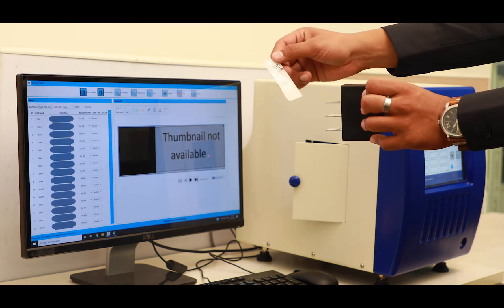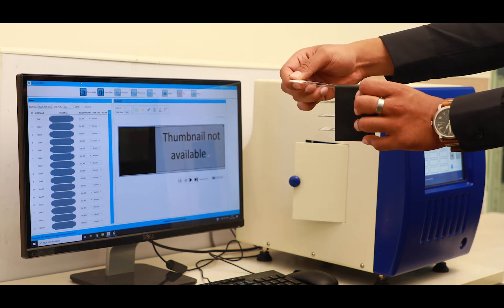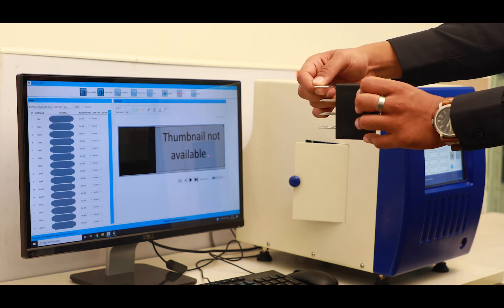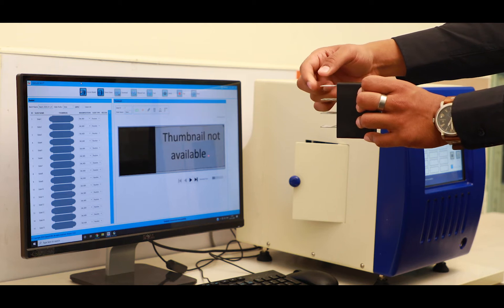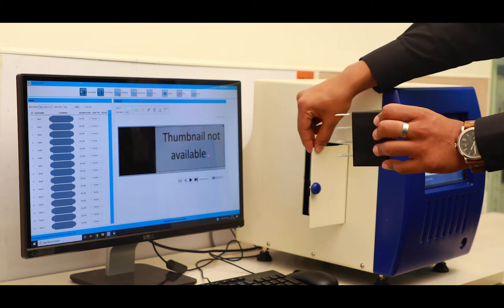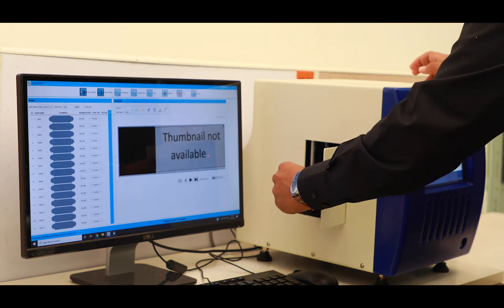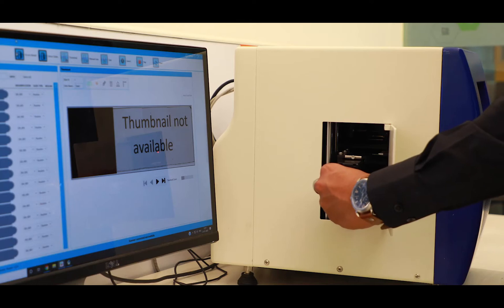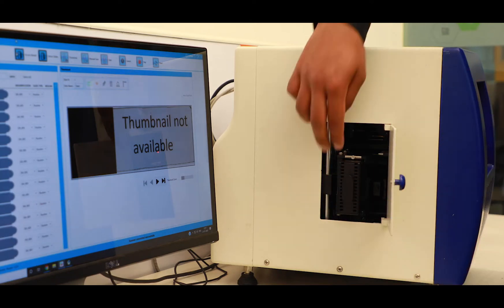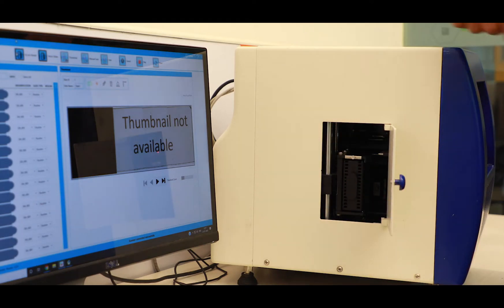Loading the glass slides is as simple as loading a disk into your computer. You simply insert the slide into the slide holding basket and then insert the basket through the access panel provided on the left of the scanner.